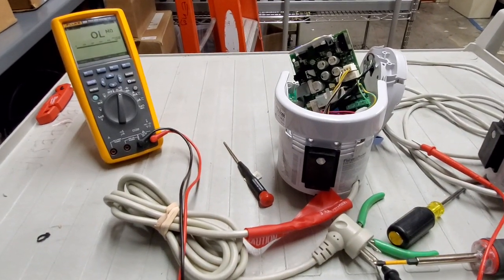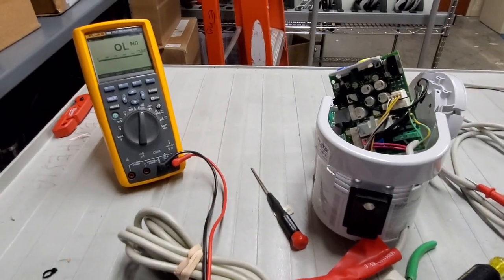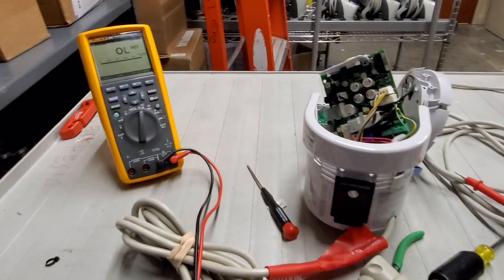So these ones you have to completely ship back to Fisher & Paykel. That's all there is to it. If they don't pass electrical safety, got to ship them back. Anyway, guys, that's a real quick anatomy of a failure. I'll show you guys what's going on with these humidifiers. There's nothing we can do. I mean, I could technically repair it, but that would be very expensive and not very time saving whatsoever. So we're just going to box them up, ship them out. It is what it is.